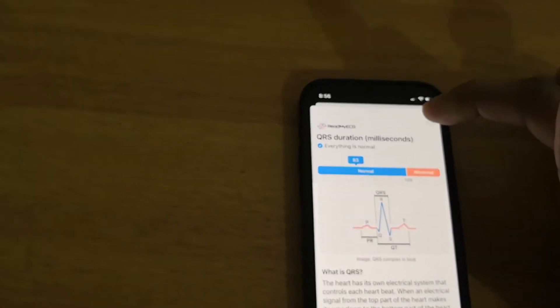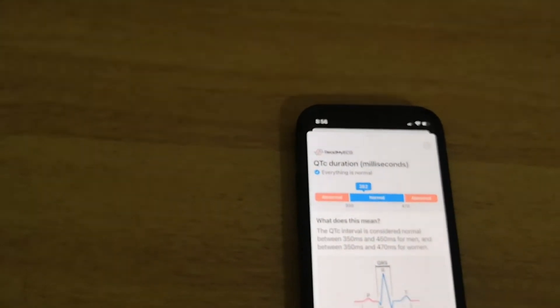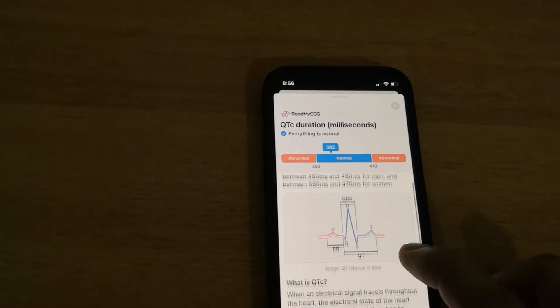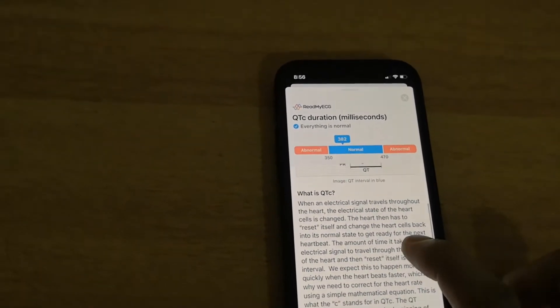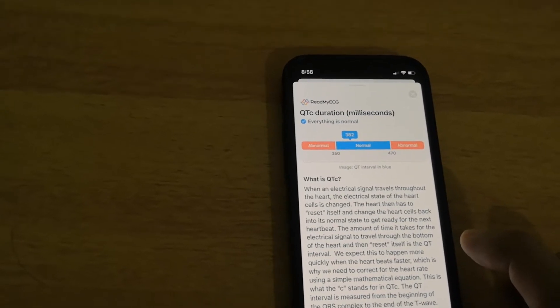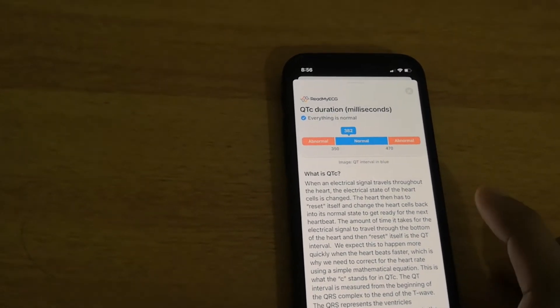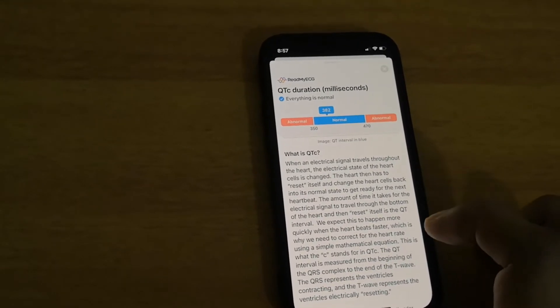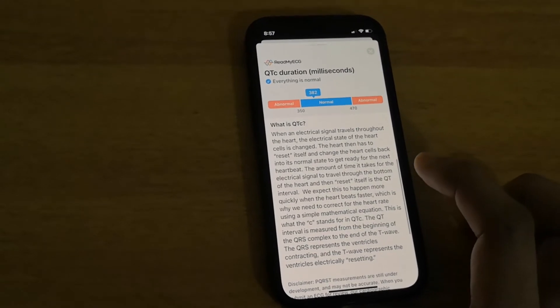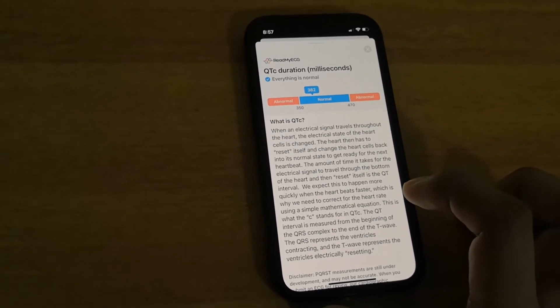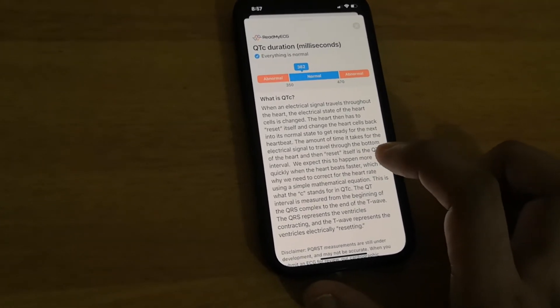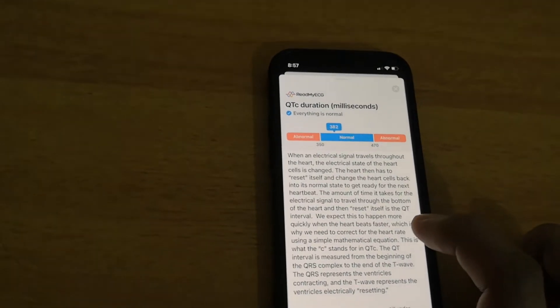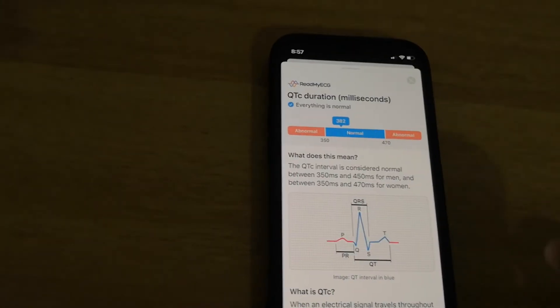You don't need to know all those details — just check whether the value falls in the normal range or not. For QTC, the normal range is between 350 and 470; mine is 382, so that is normal. The QTC interval means: when an electrical signal travels to the heart, the heart cells change state and then reset themselves for the next heartbeat. The time it takes for the heart signal to travel from the bottom of the heart and reset itself is the QT interval, corrected for heart rate using a simple mathematical equation — that is what the C stands for in QTC. The QT interval is measured from the beginning of the QRS complex to the end of the T wave; QRS represents the ventricles contracting and the T wave represents the ventricles electrically resetting.